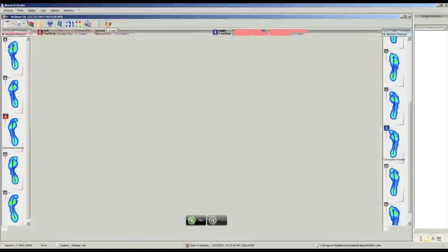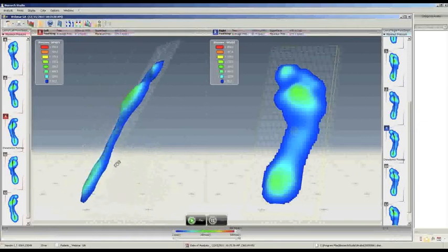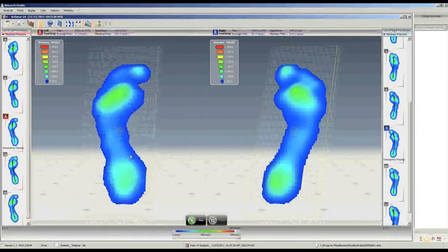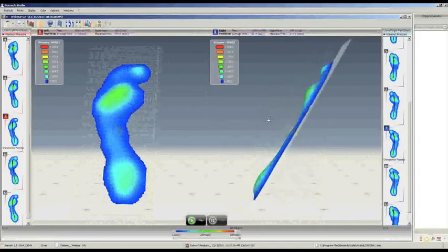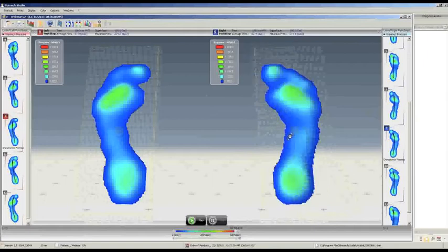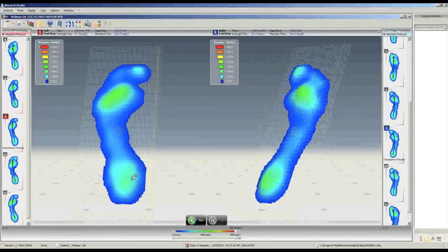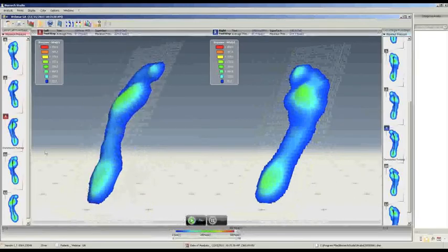Then, in the last part, it is possible to see the distribution of pressure in 3D visualization, moving the footprint in the direction we want to properly detect the 3D reconstruction. Also in this case, it is possible to start a movie to see the 3D reconstruction of the distribution of pressures during time. This visualization is also really important for creating new planter devices.